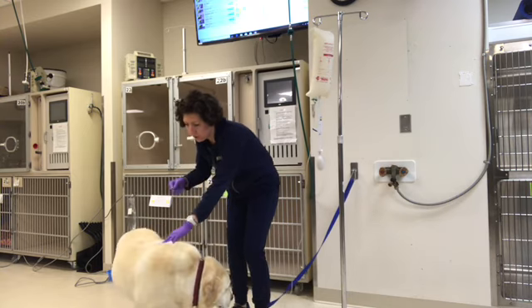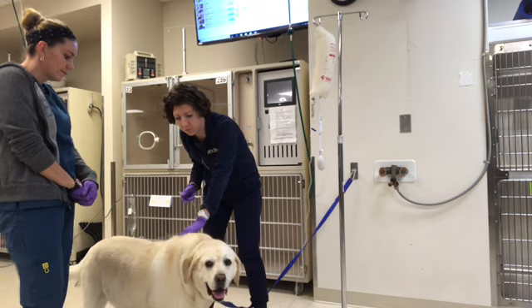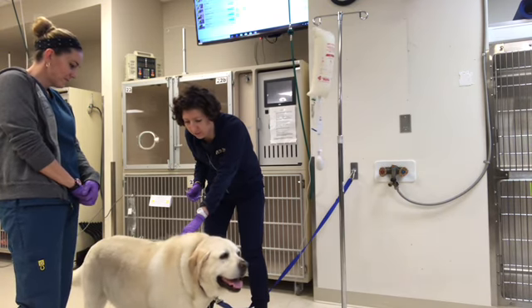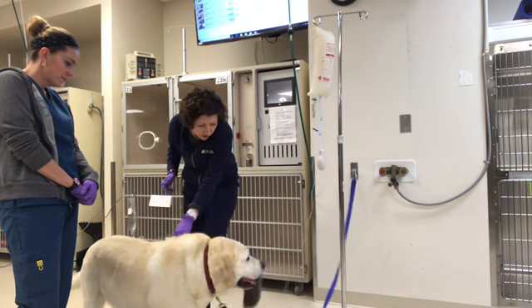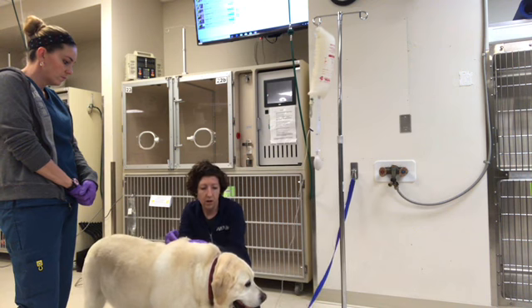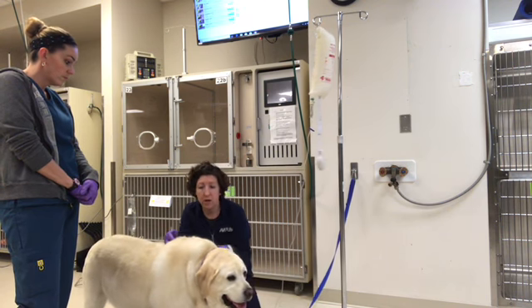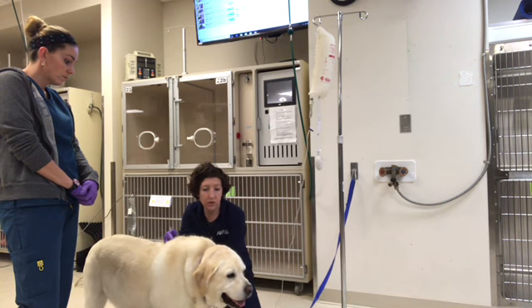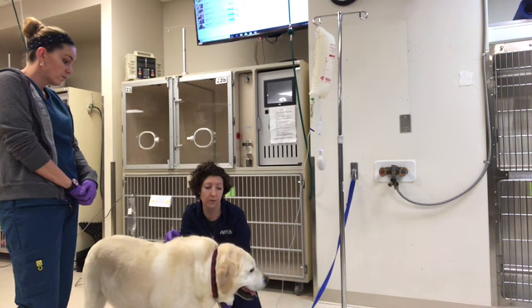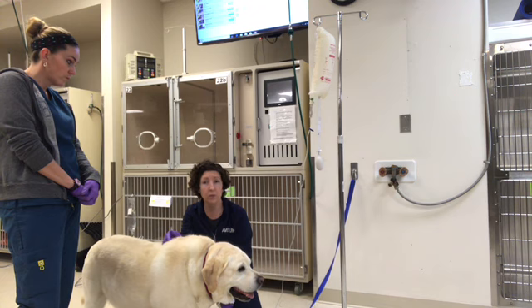I'm going to pull the needle out. I'm going to hold down on the spot for just a minute with this gauze pad to help it clot up and keep it from leaking out. And then I will explain to the owners that this will absorb into the body over the next 12 to 18 hours, and that it will gradually shift down to his chest area, and to expect that and not to be alarmed by it. And that is how you administer sub-Q fluids.